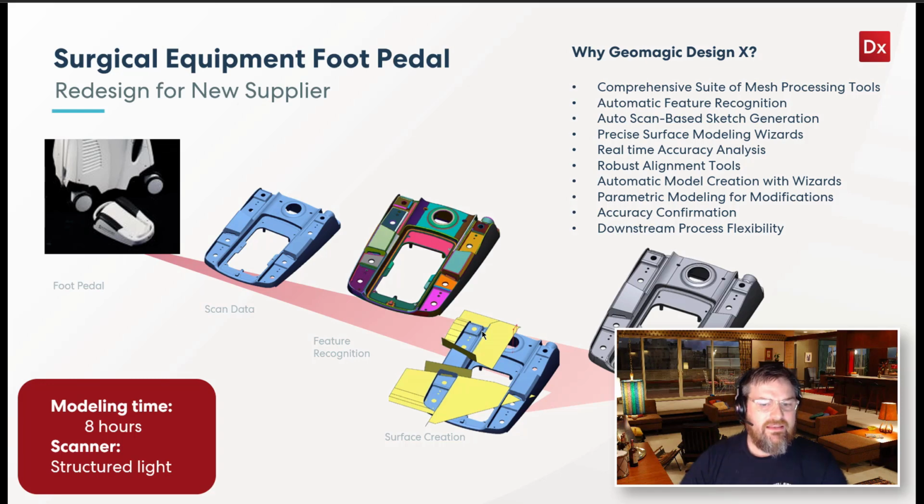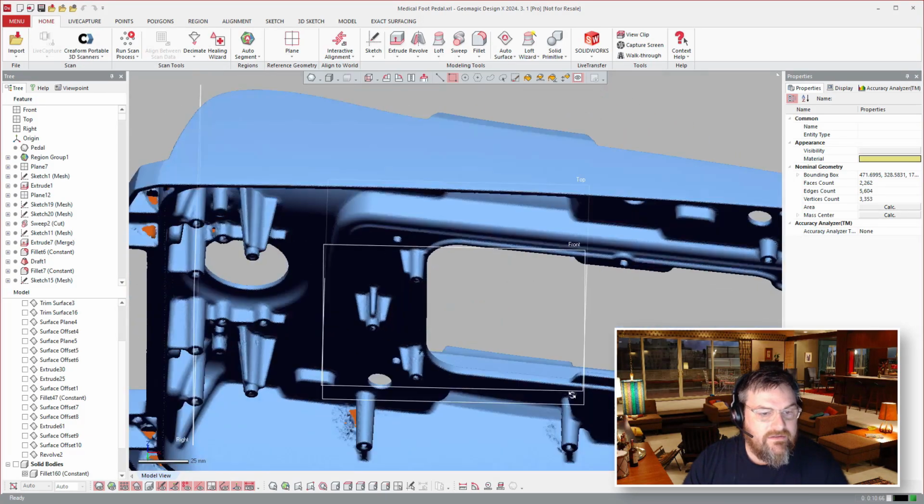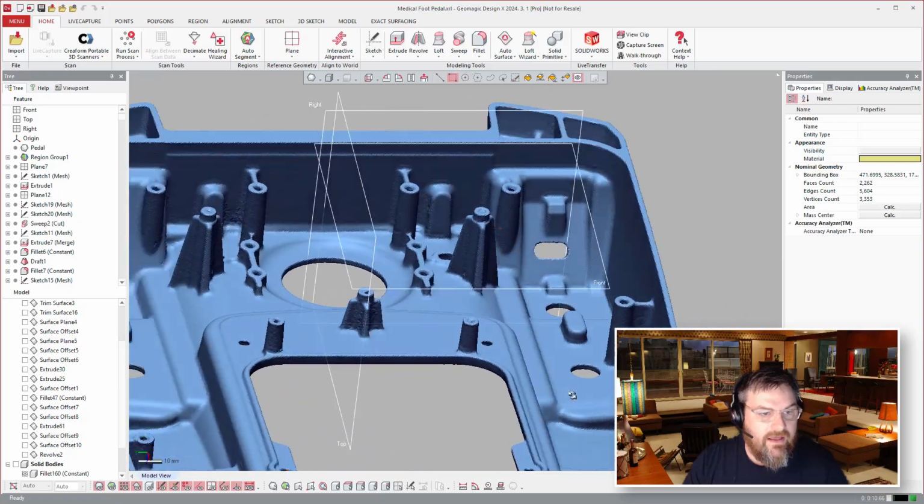In this instance, the medical world has this piece of surgical equipment, this foot pedal, and we scanned that. As you can see, it has a lot of features to it. We captured that information with a white light structured light scanner, and then brought it into Design X for modeling. So with that, I'll switch over to Design X. So here is Design X. Here's the scan data. As you can see, it looks amazing, and there's a lot of features here.